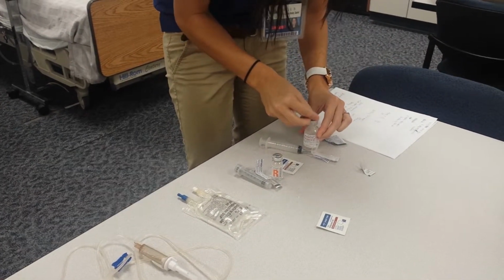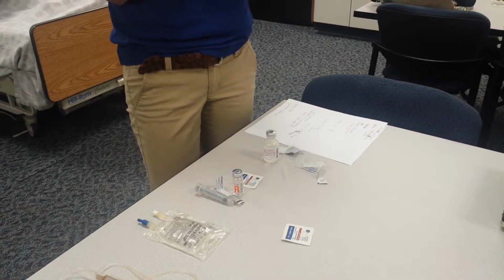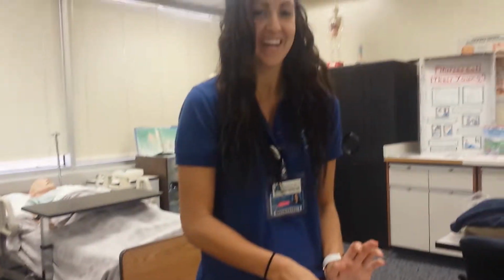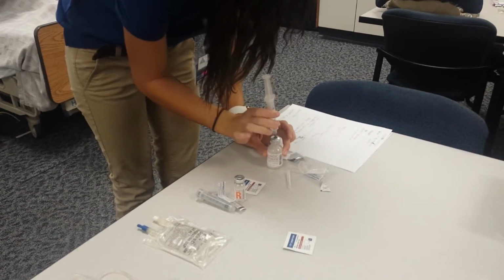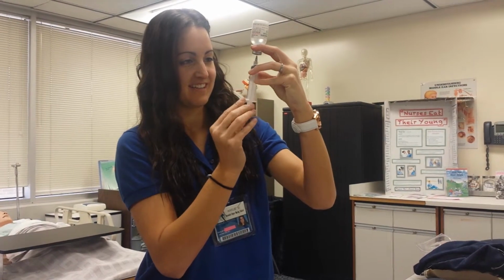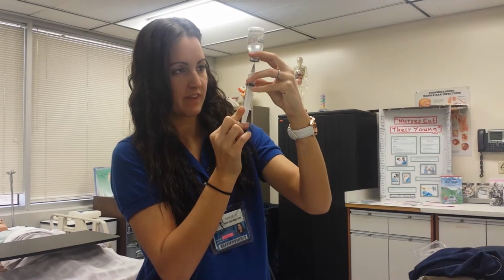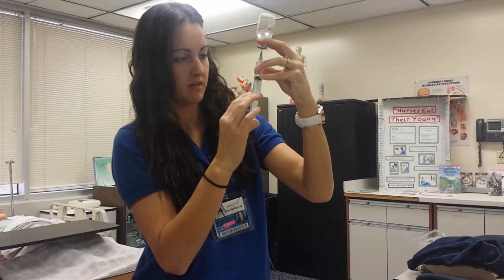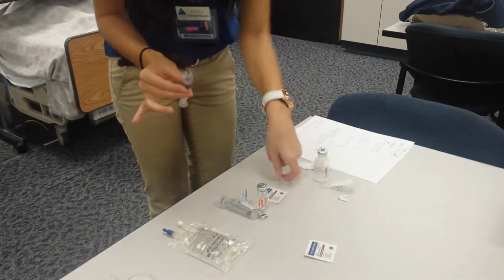Cleanse the top of my vial. Before doing this, I would have washed my hands. Sorry. So my hands are clean while drawing up. And we have 6 cc's of a flush now. I'm going to recap this until I need it.